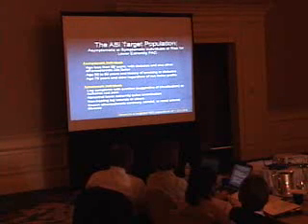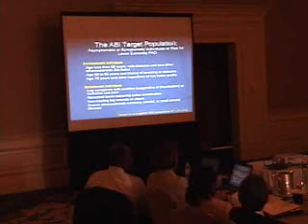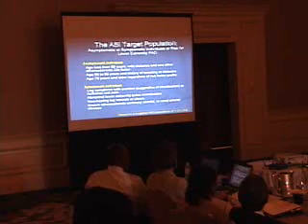Do you need to have those as part of a screen? Do you need to have pressure volume? No, it's just a form of completeness for the top. It's not a screening tool. As far as the screening, you recommend just do the ABI, and then you recommend the next step, which would include identifying the location of the stenosis. Right, that's right.